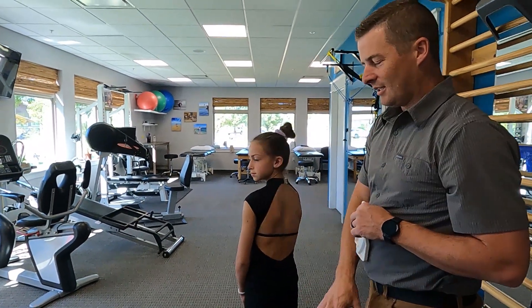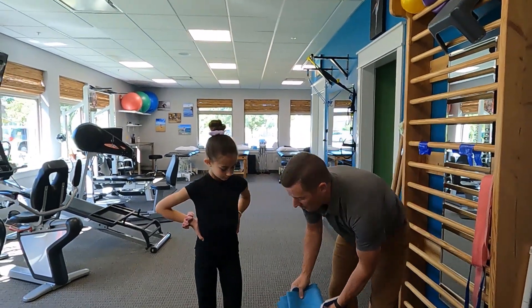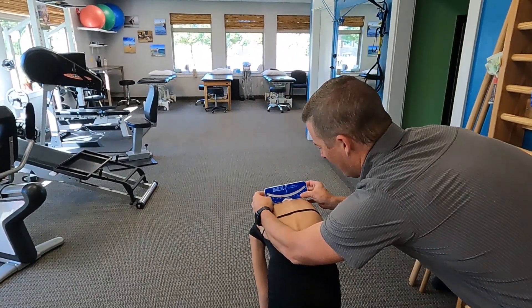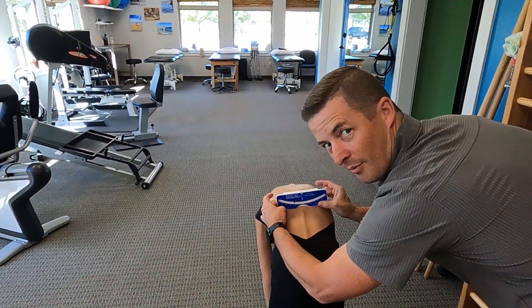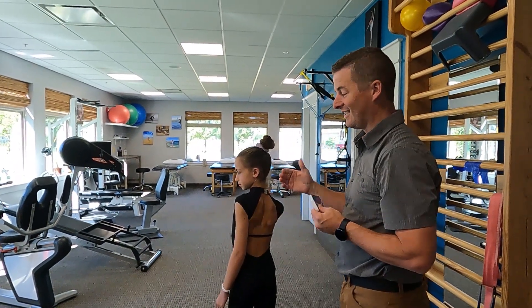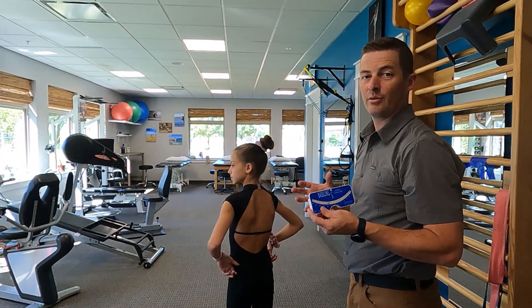If you see a difference between sitting and standing, it could be how they're standing, but it could also be that they have a leg length difference. So let's try this, Sammy — let's put this under one leg. Go ahead and touch your toes again. Now we're at 13–14 degrees — much higher on the scoliometer reading because this is mimicking her right leg being longer than the left leg. So you have to be careful if you're doing scoliometer readings in standing; you may want to check if they have a leg length difference because it can definitely influence the rotation in the spine.